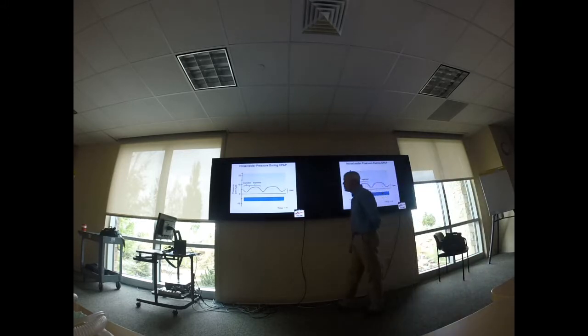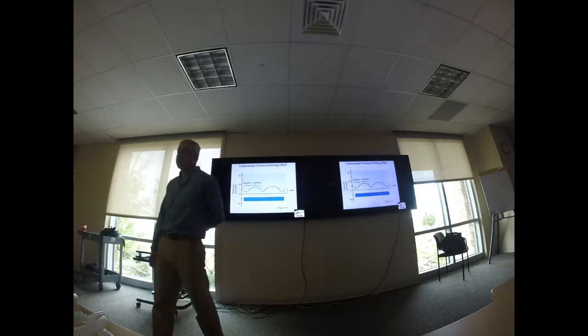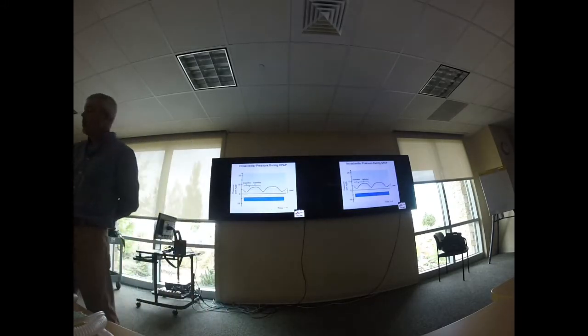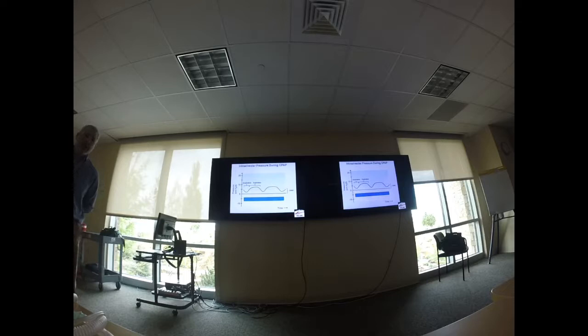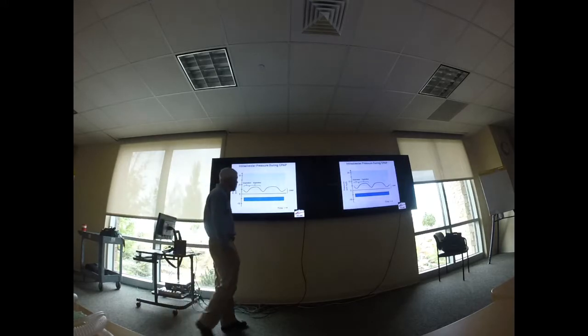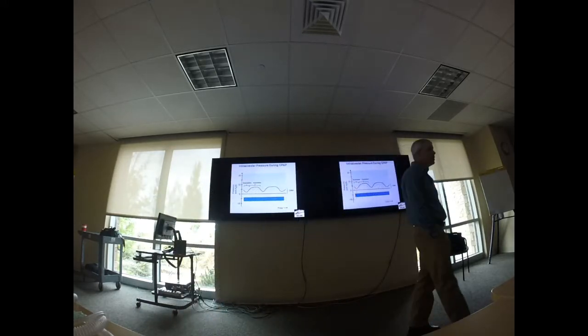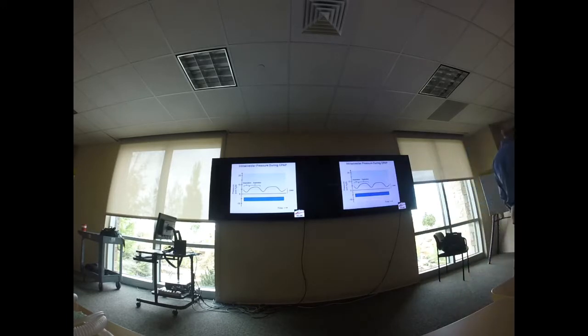So here is a graphic representation of normal ventilation, which is the blue line, and continuous positive airway pressure. CPAP, I know, is something that you guys use in the 911 environment. CPAP delivers a continuous positive airway pressure throughout inspiration and expiration.